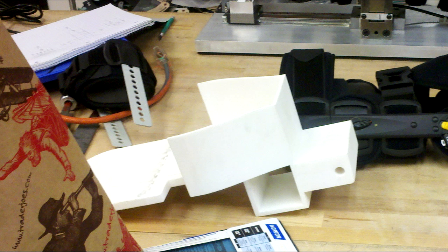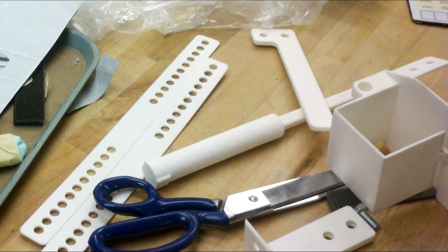We originally used stereolithography, or SLA, to produce the first version of our device. The footrest pictured above is of our original footrest, which turned out to be much larger than specifications. We also used stereolithography to make support brackets and an upper mount which kept the knee brace in line on top.